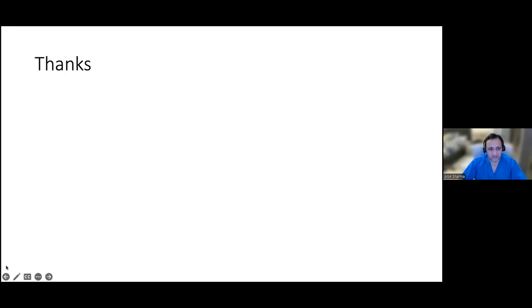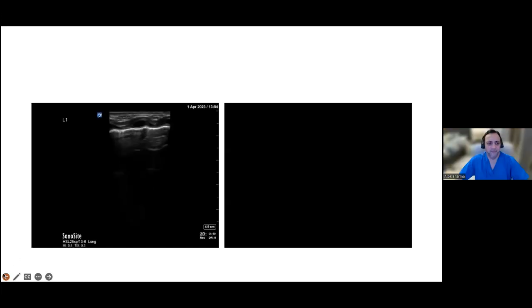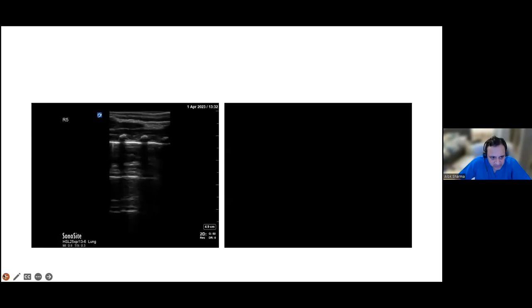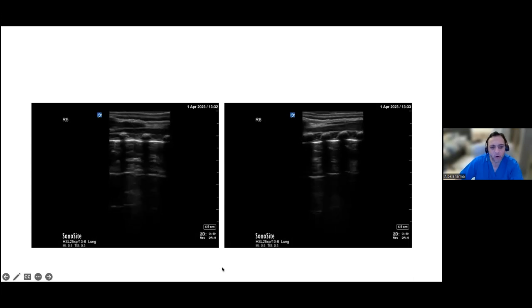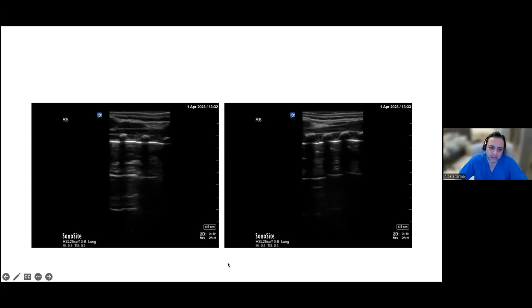I would agree, and I think you've clearly demonstrated what looks like a completely normal lung to me. We'll just go to your right-sided images. Here we are. On this left. So, a very nice image. Definitely from my perspective, the top 3 centimeters are very well visible. And then you can see intermittently as the baby inspires, you can see A-lines right to the bottom. Again, gain could go up a little bit just to give you a slightly brighter image. And what I'd say is that instead of 5 centimeters, I think 4 would be sufficient to give you the meat. And actually, because you'd be focusing on a smaller area, you'll get a much better image. So don't hesitate to drop your depth a little bit.